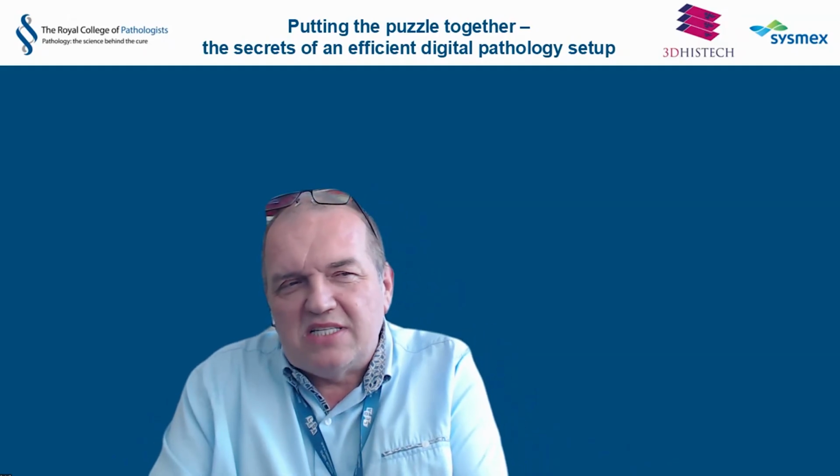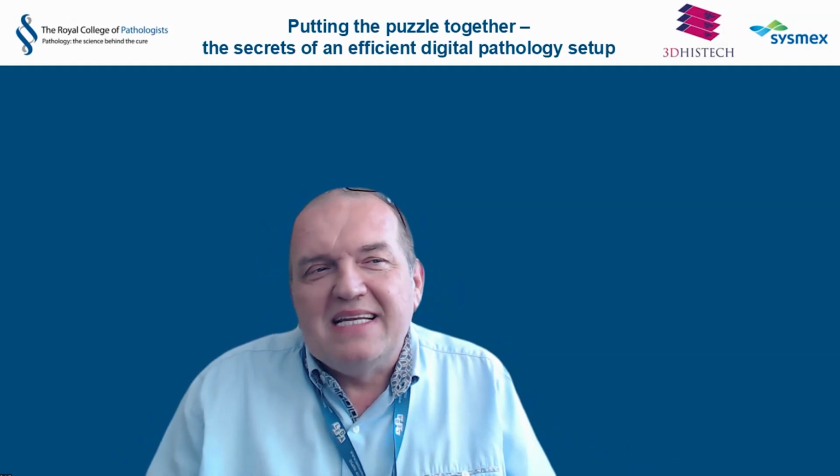You will gain in resolution, but depth of focus is going to kill all of it. Plus, it's significantly longer time. Therefore, I suggest everybody go with the 20x scanners, but the native scanning image that you will see will be 40x, and Philips UFS, Aperio, and all of the others are running at this magnification.